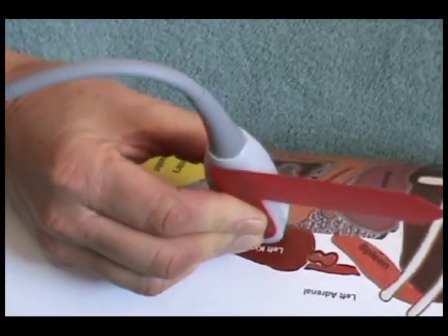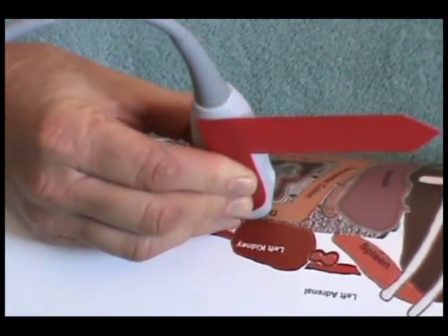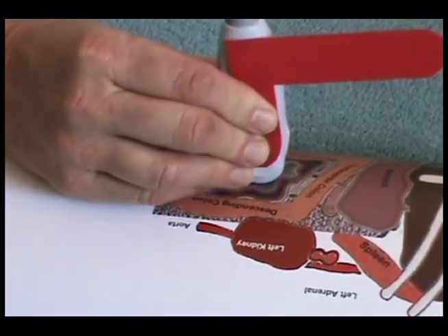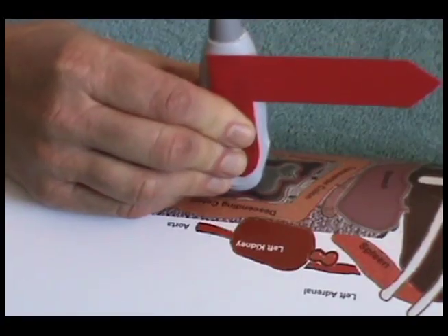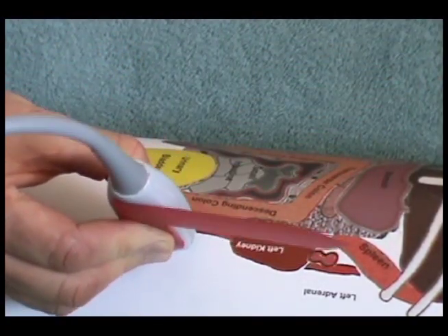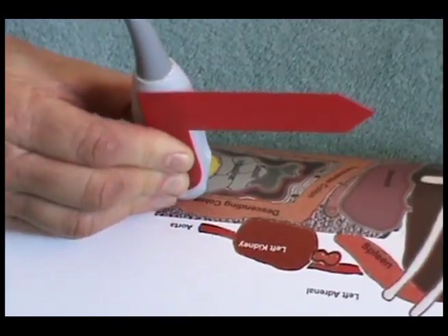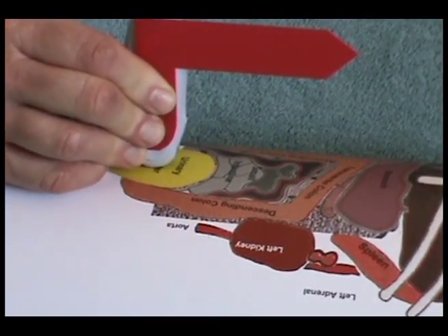As we zigzag, we will move slowly caudally toward the urinary bladder, reaching it in about 3 passes. The purpose of the zigzag pattern is to examine the left caudal quadrant of the abdomen for effusions or any lesions of the intestines or mesenteric lymph nodes.